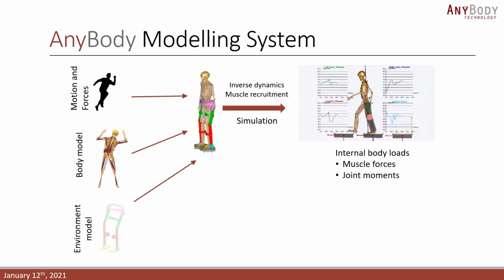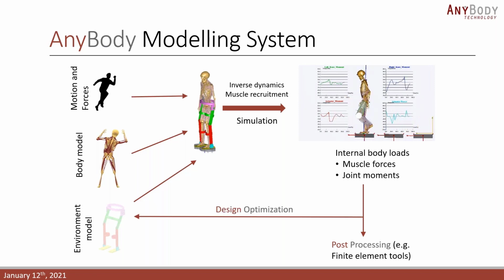You can then output the results and use them for some post-processing, which, for example, could be with some kind of finite element tool. But many users also close the loop completely by doing some kind of design optimization and then run this cycle multiple times.